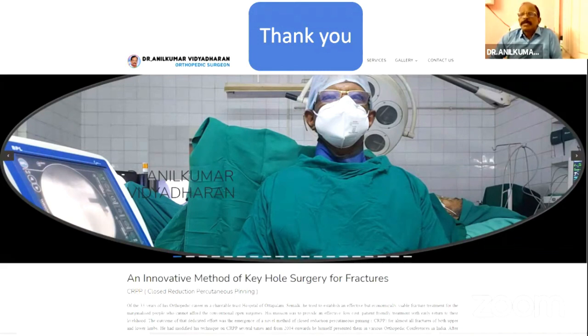Because if we are going for checking, there may be fatigue of the hands of the assistants or my hand, and the reduction may be lost, or the spike may go into this neurovascular bundle. In my experience, this is the best technique for avoiding these iatrogenic neurovascular complications by the surgeon.